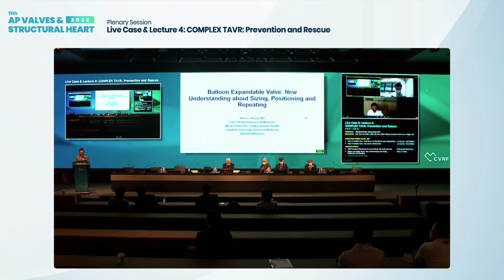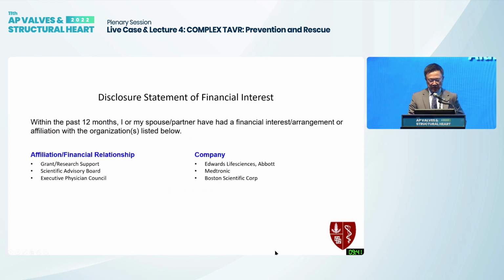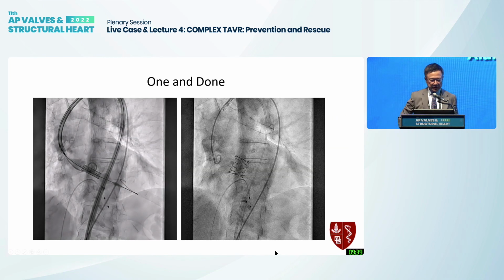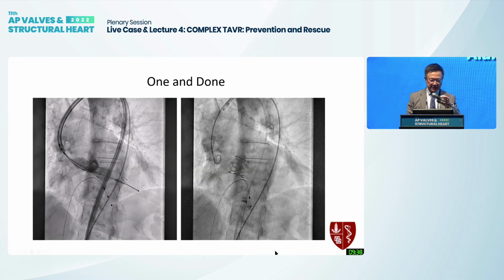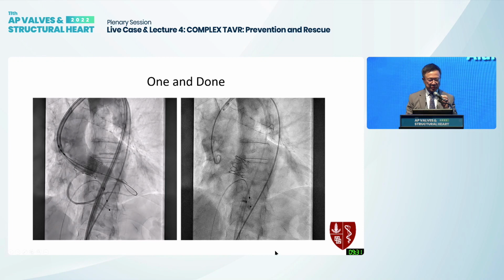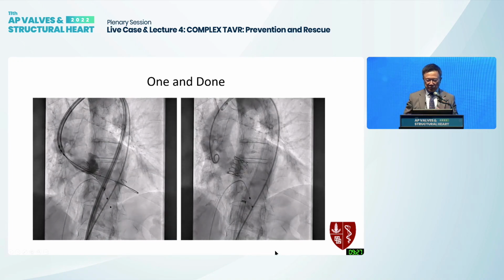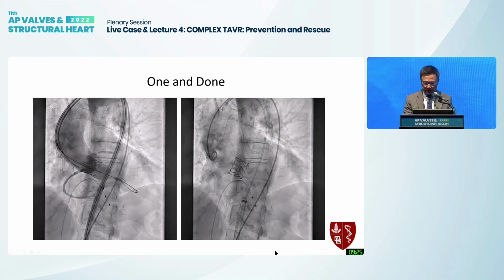Thank you very much, Eberhard, and it's a pleasure to be back in person in Seoul, obviously. So this topic was given to me, and I thought about it quite hard because we know from many of the live cases today and yesterday that it seems like a very simple procedure. We put a valve in just like a stent and we inflate it and we're kind of done, and pretty much that's it.